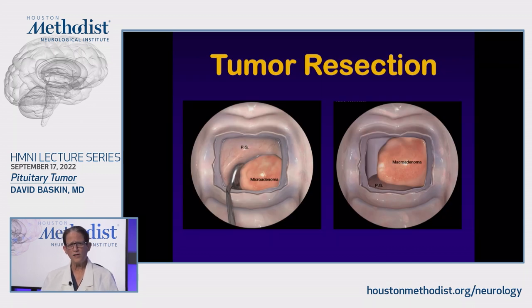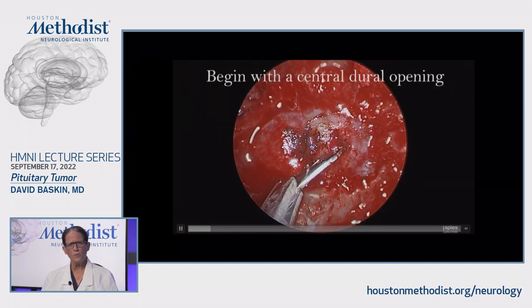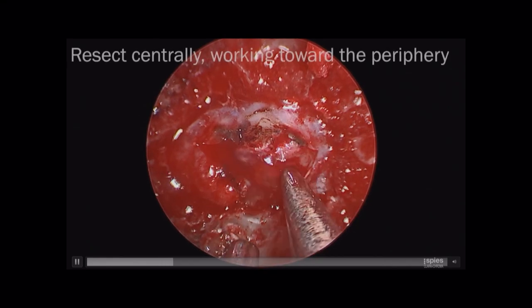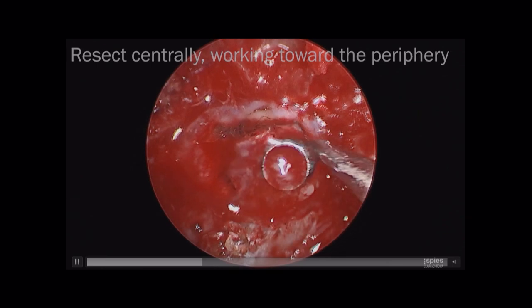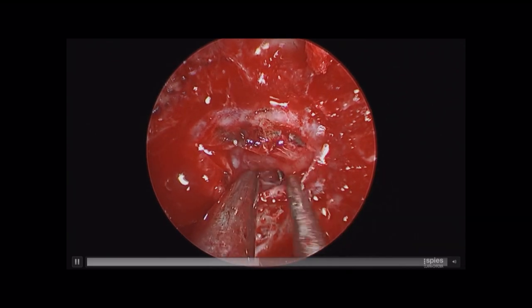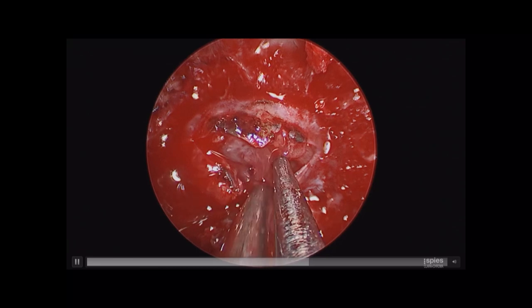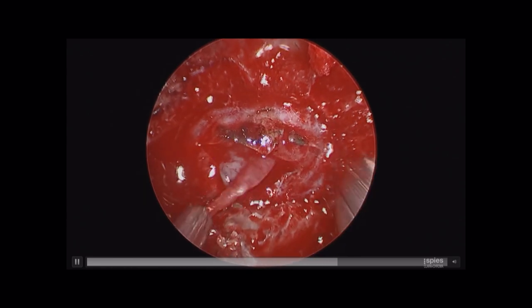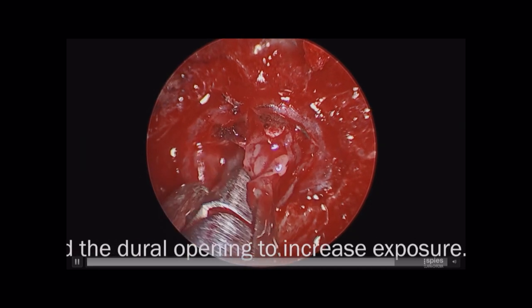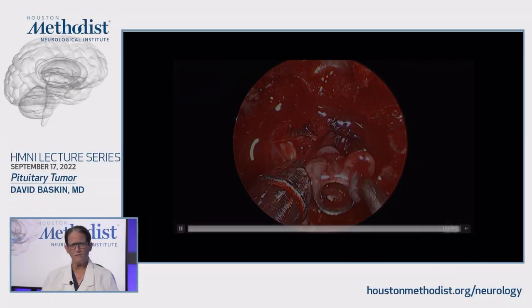Now the tumor resection. Find the tumor and dissect it away from the normal gland — fairly straightforward in most cases. Open the dura more widely, beginning with a central dura opening, then working out laterally. As you core the tumor, start by making some room in the center, then reach out to the sides and get the tumor to come away from the cavernous sinus walls slowly. Sometimes the tumor is very soupy and suction is the best way to remove it; sometimes micropituitary rongeurs are best, and sometimes ring curettes are your friends. The more widely you open the door, the better off you are. In the end, you want to see the medial walls of the cavernous sinus intradurally.